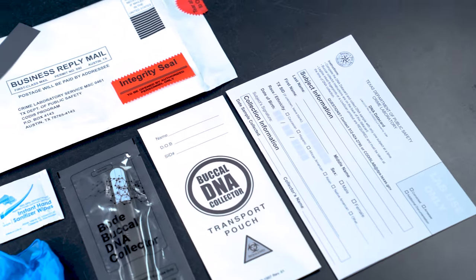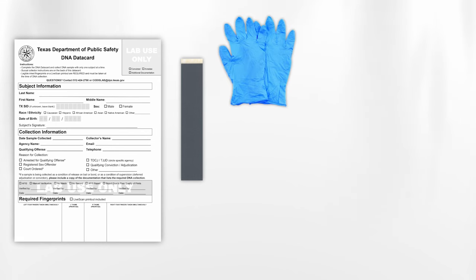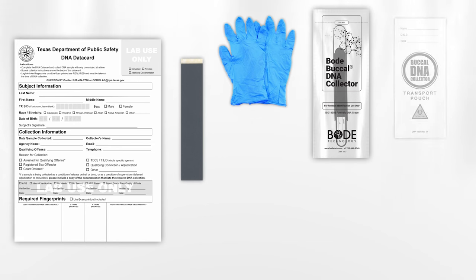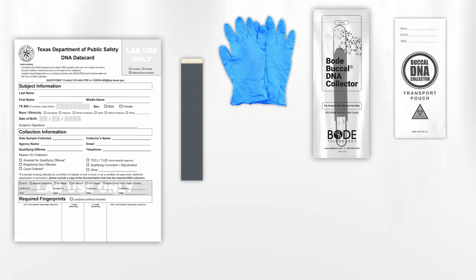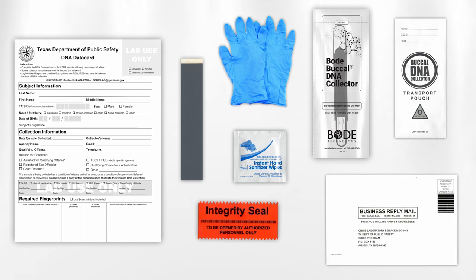Each kit contains everything you will need to collect and submit a DNA sample: one DNA database information card, one ink strip for thumb printing, one pair of disposable gloves, one DNA collector, one transport pouch, one integrity seal, one sanitizer wipe, and one prepaid postage shipping envelope.